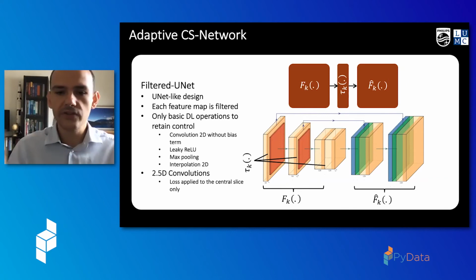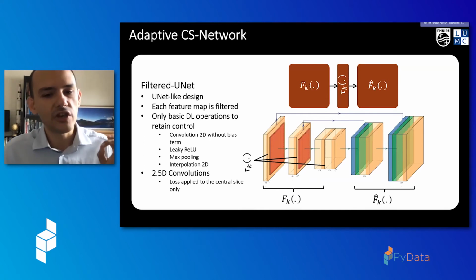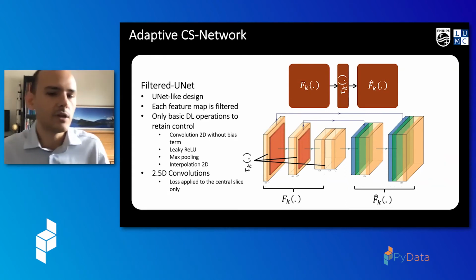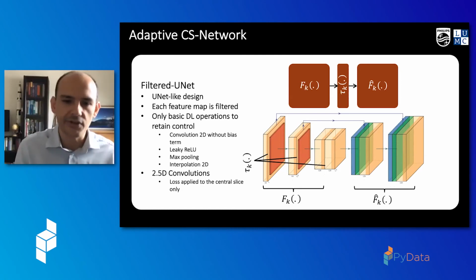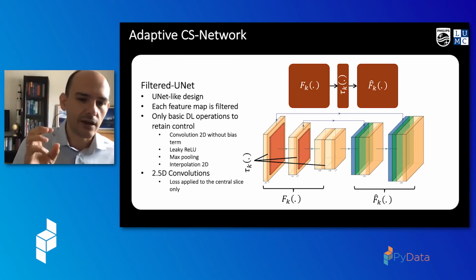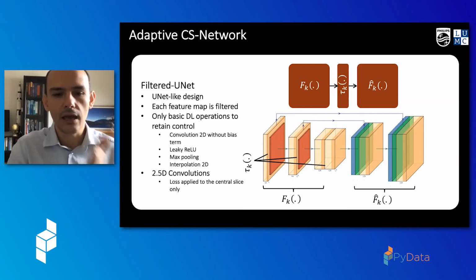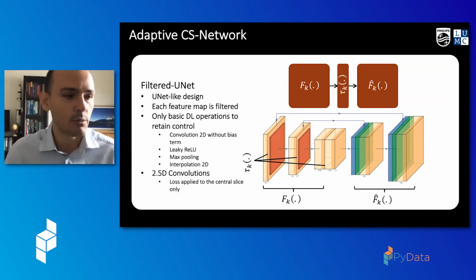Now, this is maybe a bit technical, but one thing I would like to mention is that we achieved great results just by sticking to very basic deep learning operations. In the literature nowadays, you are overwhelmed by a lot of different architectures and computations. By design, we stick to a very simple one, because we knew that we could control it and inject it in a much bigger framework. That was a very powerful idea, and it works like a charm.